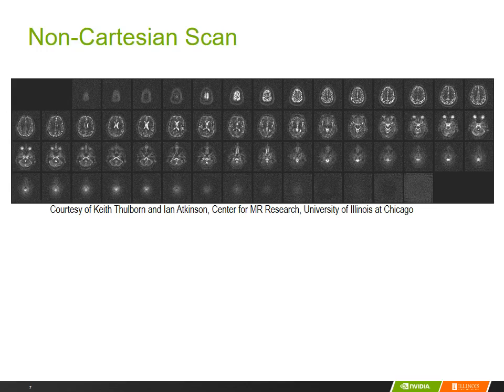And also for brain tumor treatment, we can use the sodium map evolution to tell if the brain tumor cells are going through the process of cell death, so that we can detect the efficacy of treatment before we see any anatomic change in terms of tumor shrinkage. And we can actually predict the tumor shrinkage by observing the shift of the sodium levels in the tumor cells.